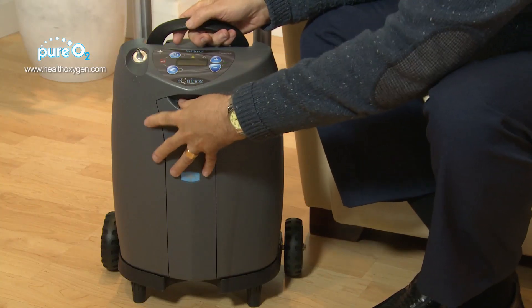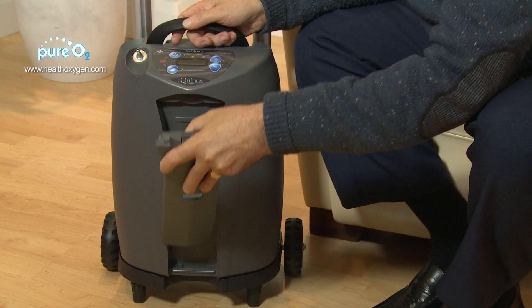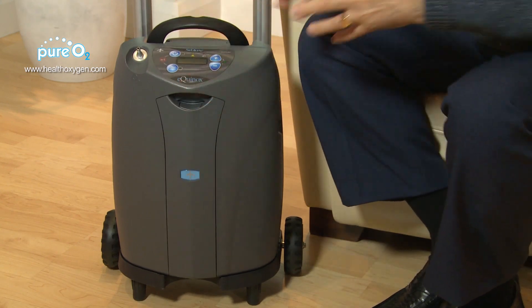You take the battery out from the front, change it over, and clip it back in. The battery can be charged out of the machine or inside the machine, as long as the machine is plugged into the main socket.